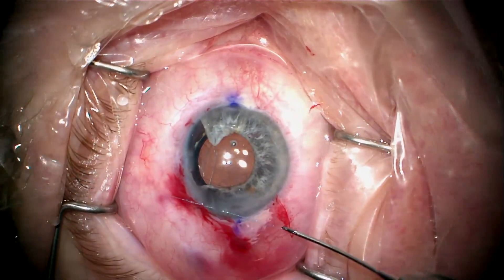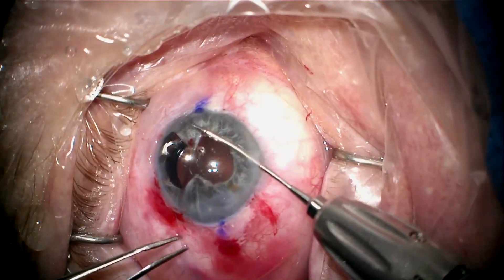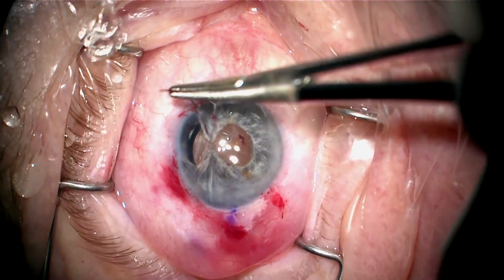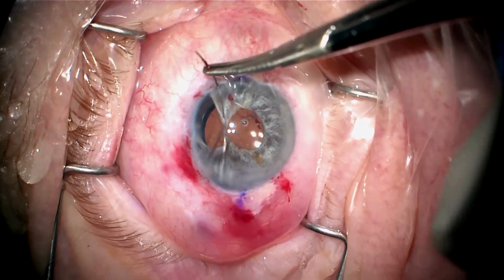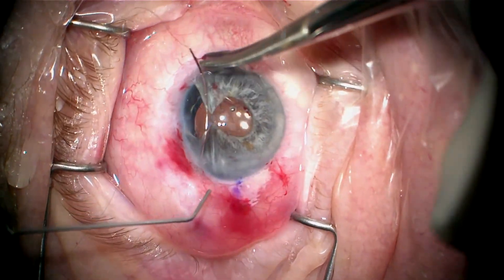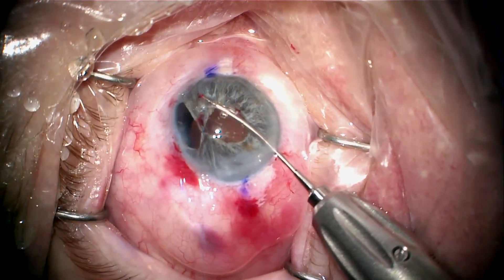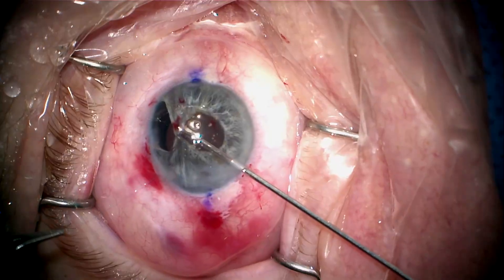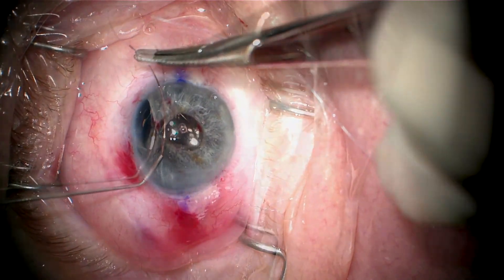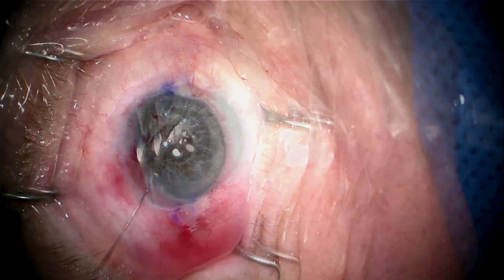As I bring this down, I'll bring the knot into the eye and tighten it by pulling on one side outside the eye and the other side inside the eye. I don't want this to cheese-wire, so I'm not going to bring it completely together. I'm going to add a second suture above and below to reinforce this so it doesn't pull through. Here I'm adding the second suture, bringing it together, and cutting that with a 23-gauge microscissor, then another suture on the other side to reinforce it.